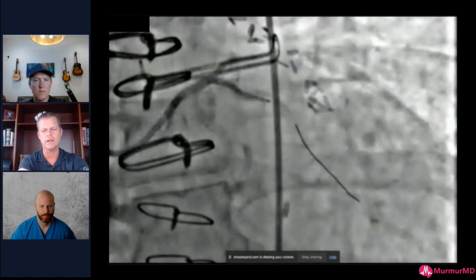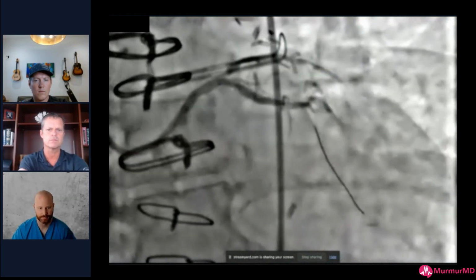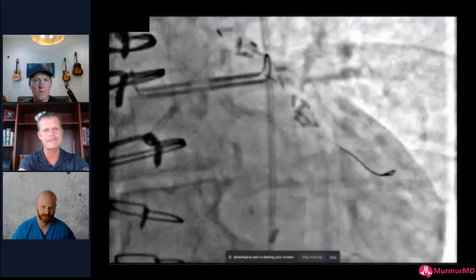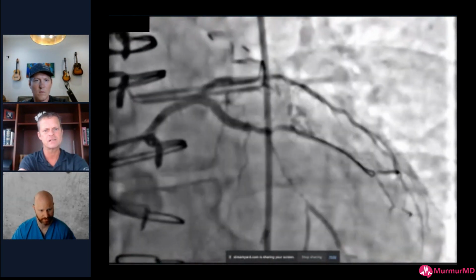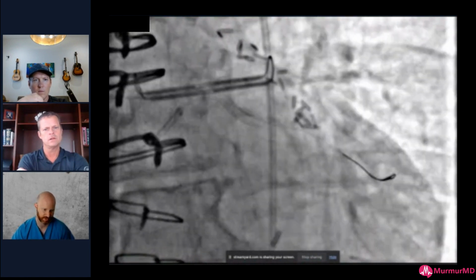Yeah, I love that. I think you deliver through a guide extension and then pull back. I think that's the way to go. And then we're going to stent this. I'm pretty sure this is a big boy Megatron stent. I think we got a very good result. We were able to get great flow to that obtuse marginal system. We'll see how he does.